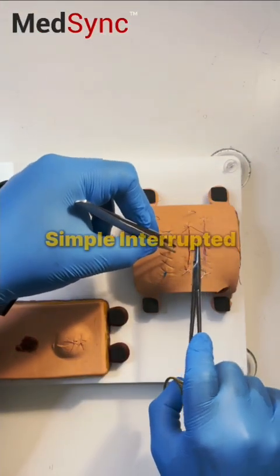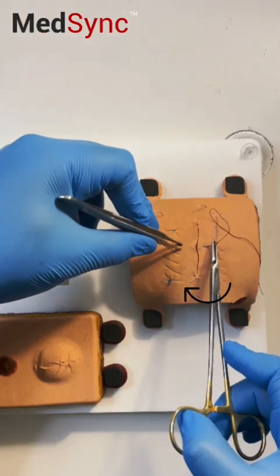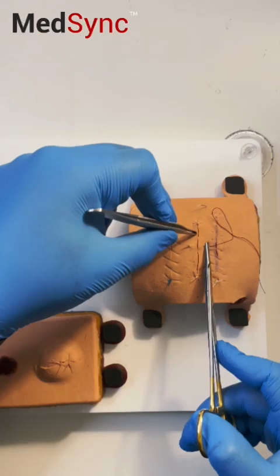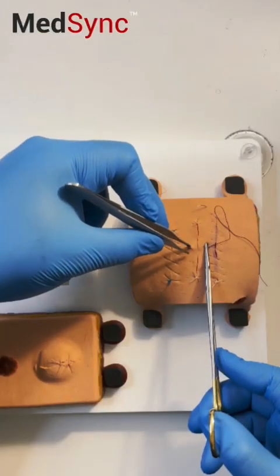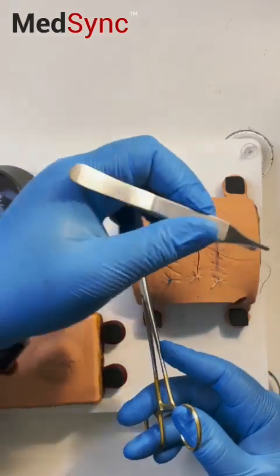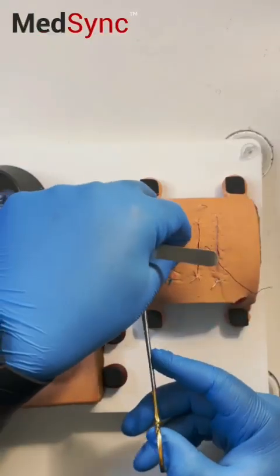The simple interrupted suture: enter at 90 degrees, rotate your wrist, come out opposite at equal distance from where the wound itself is. Here's the key to speed — pull the needle through, palm your forceps like this, and grab the suture.